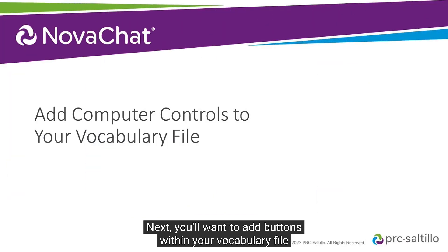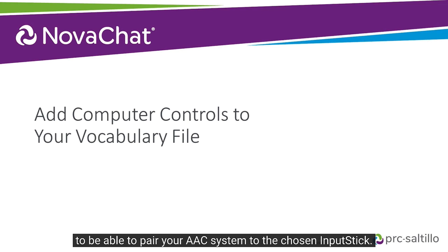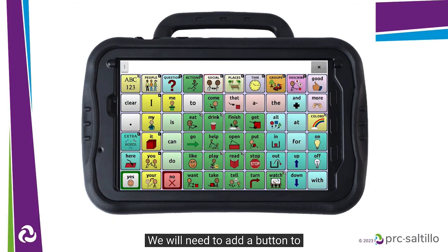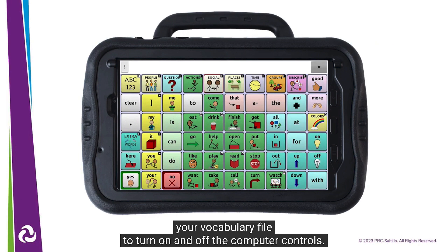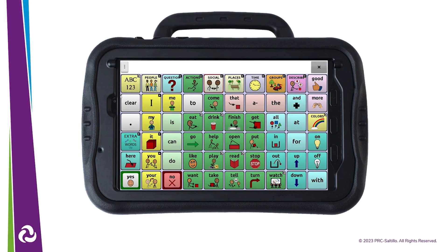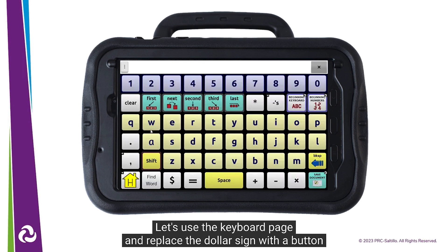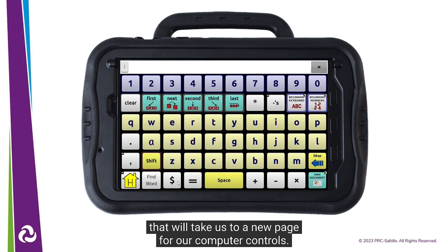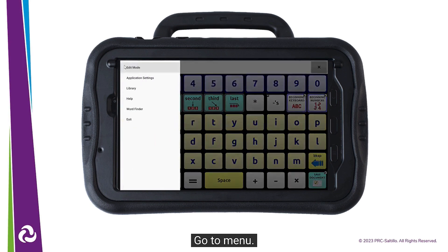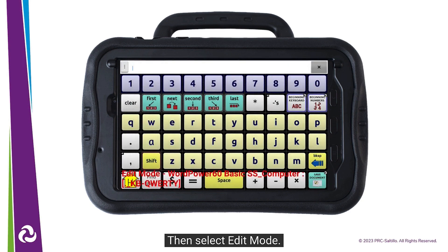Next, you will want to add buttons within your vocabulary file to be able to pair your AAC system to the chosen input stick. We will need to add a button to our vocabulary file to turn on and off the computer controls. Let's use the keyboard page and replace the dollar sign with a button that will take us to a new page for our computer controls. Go to Menu, then select Edit Mode.